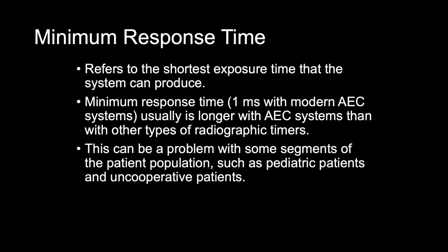The term minimum response time refers to the shortest exposure time that the system can produce. Minimum response time is 1 millisecond with modern AEC systems. It is usually longer with AEC systems than with other types of radiographic timers. Other types of radiographic timers are usually able to produce shorter exposure times than the AEC devices. Sometimes this can be a problem with some segments of the patient population, such as pediatric patients and uncooperative patients.